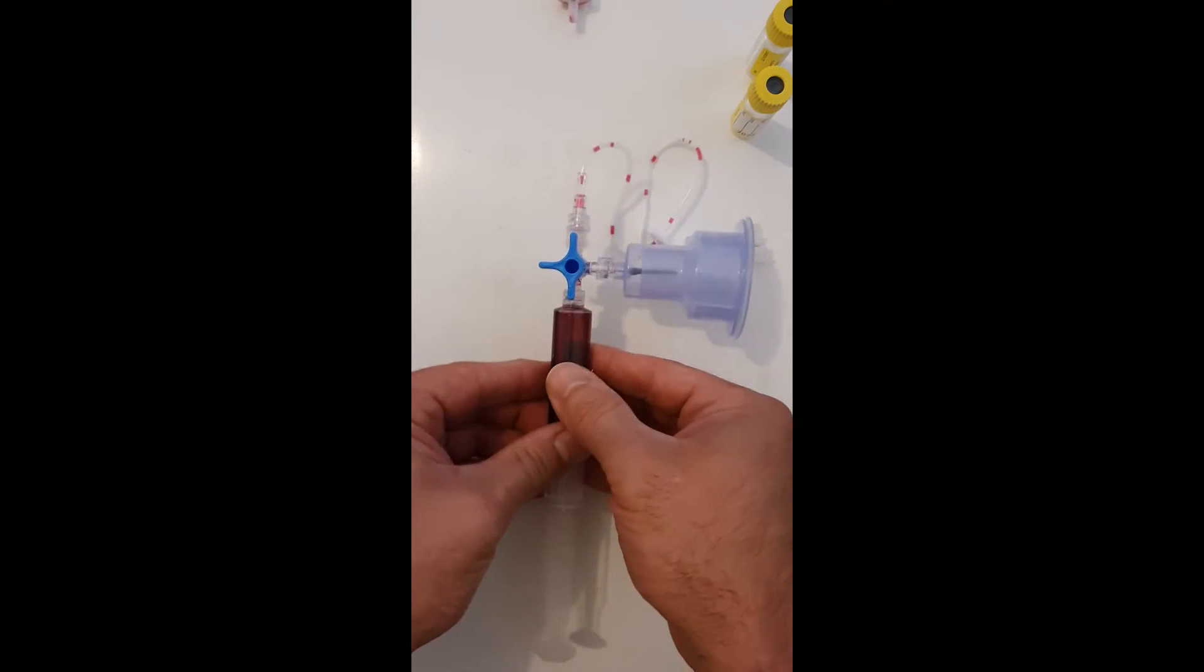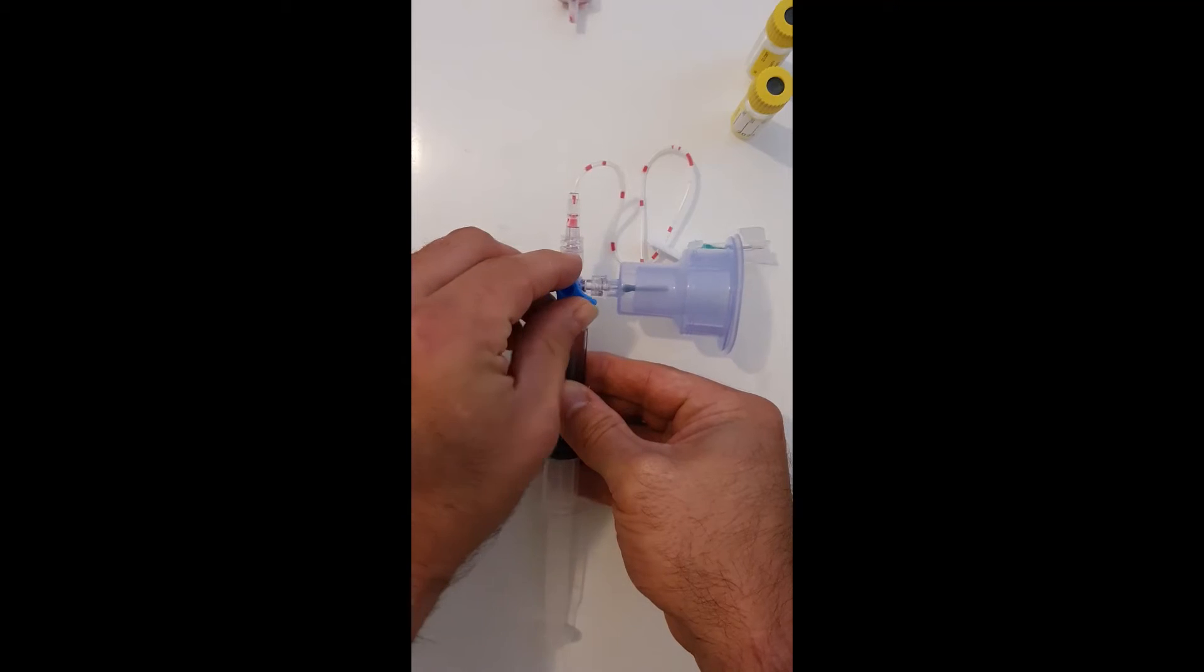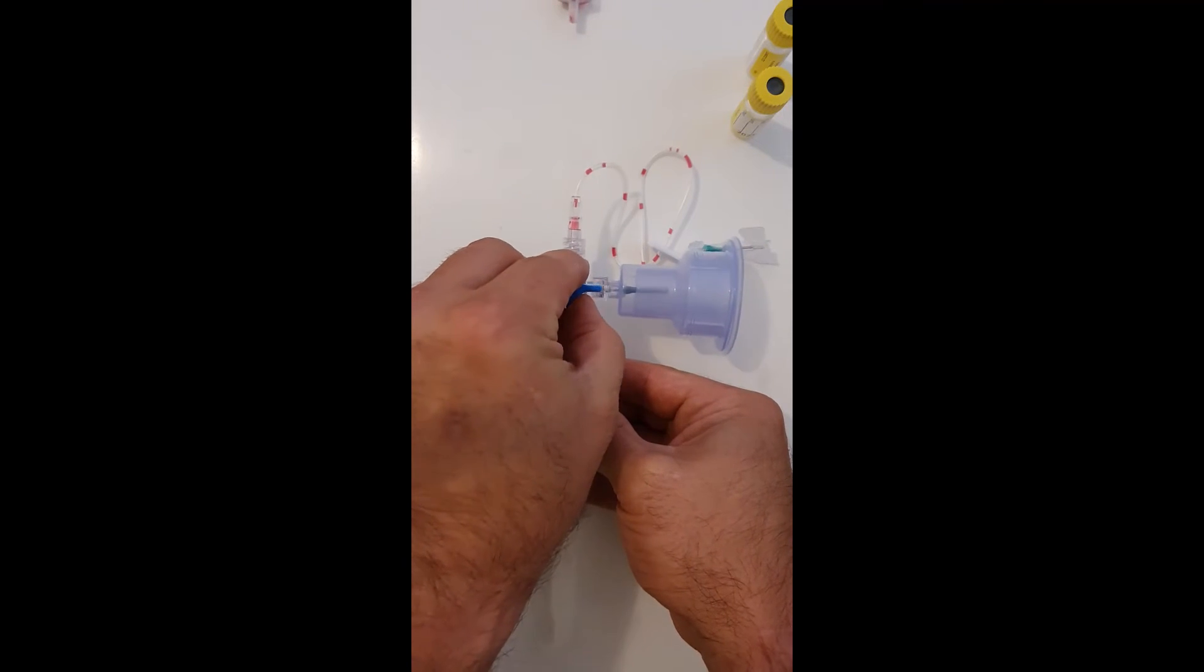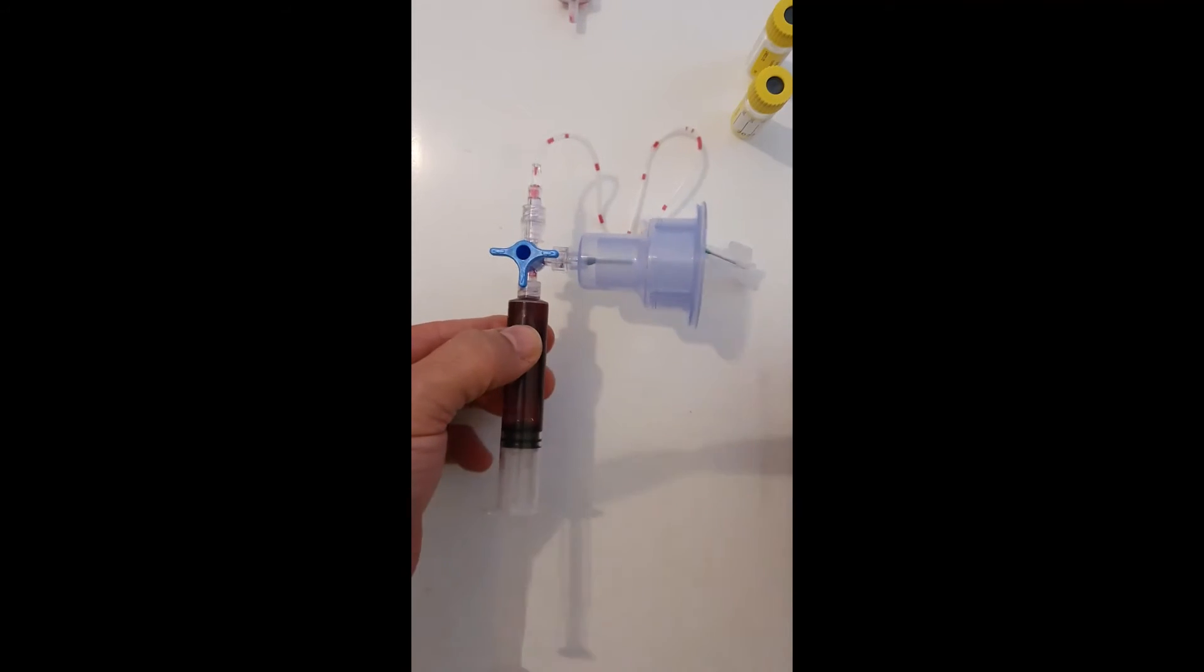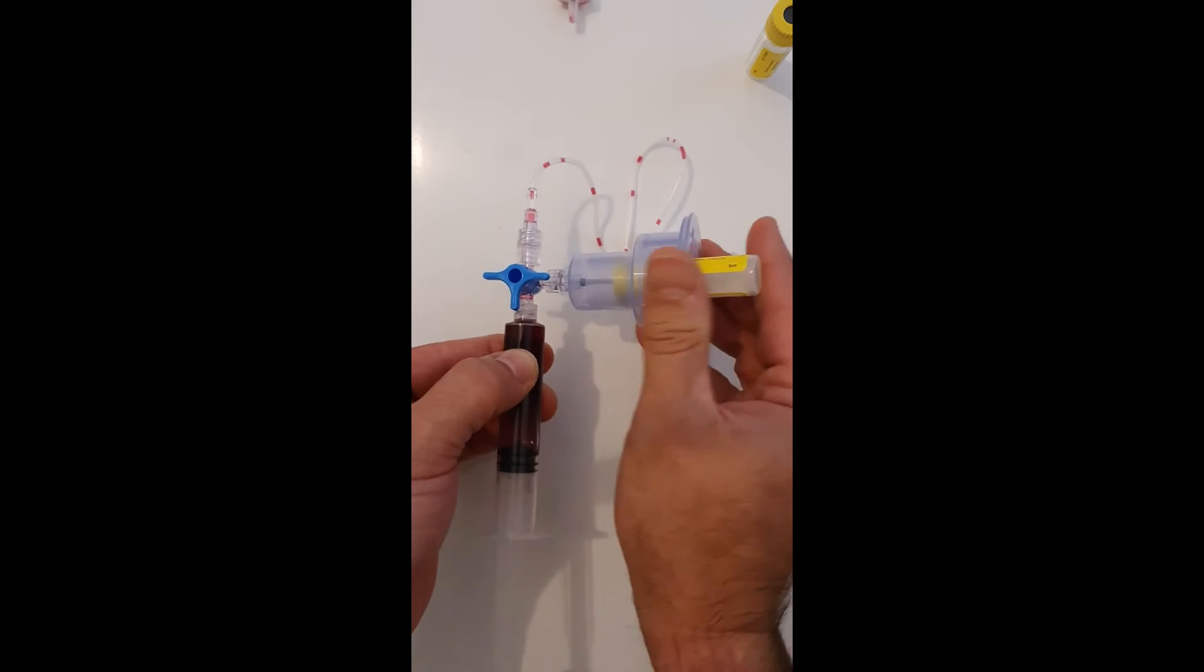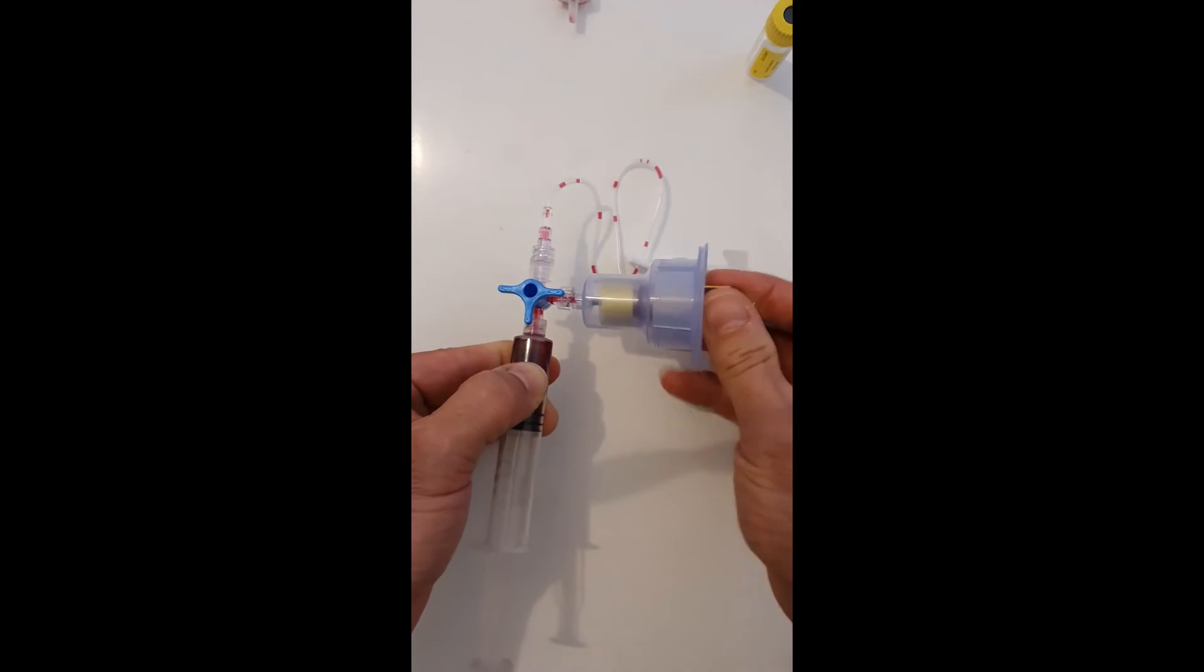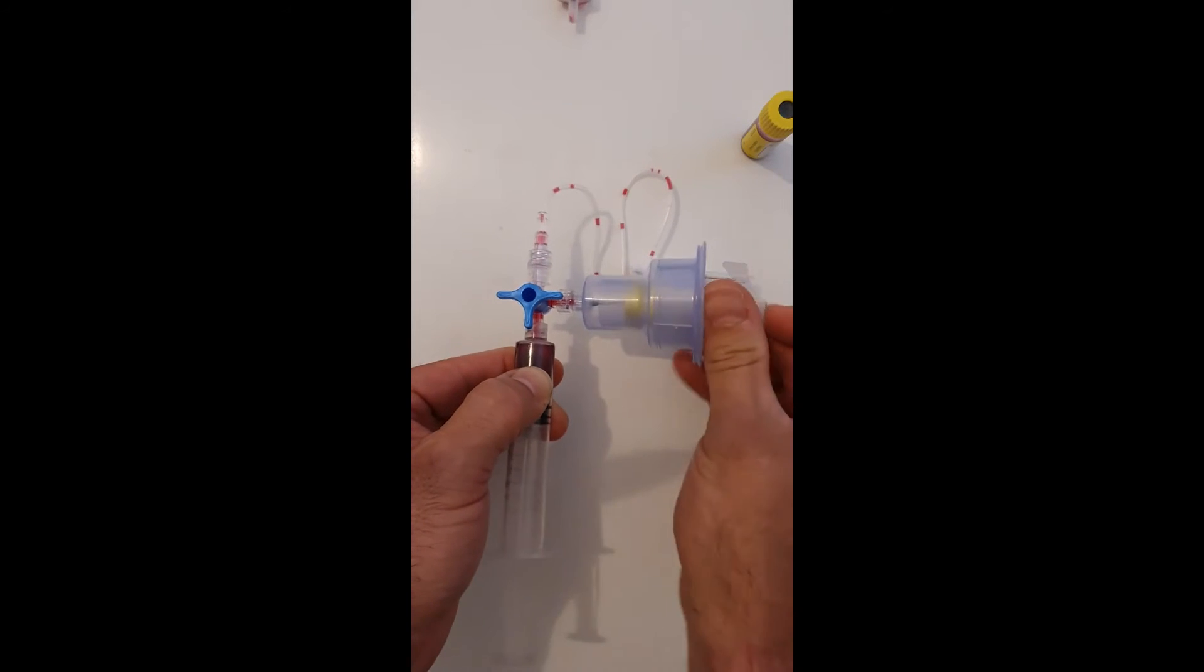Once you're in this position then, all we're going to do is do a quarter turn to the right on the key to ensure that the flow goes in this direction. We place on the vacutainer, the tube fills and the second container goes on.